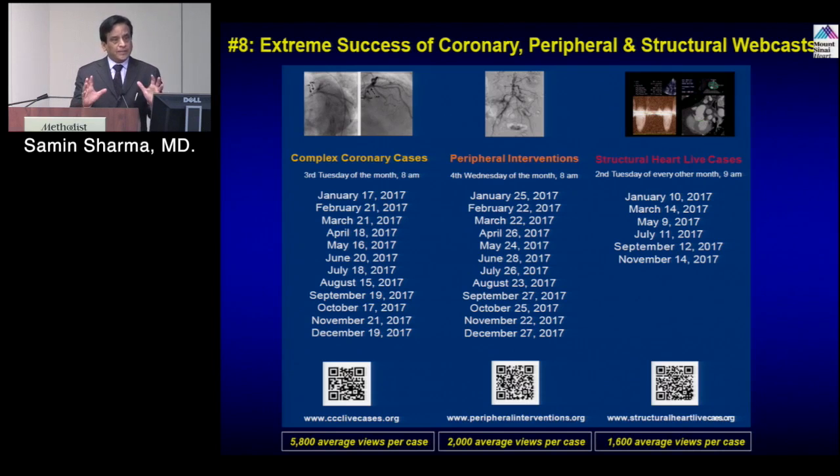Yeah. So very good. That's the important point, is that you have an unexpanded stent case that has been sent to you. Why? Because if you would have been in your lab, you would have used the atherectomy and the stent would have expanded. That doesn't happen in the lab where you are. So we always say that it was sent to you. So now the question is what to do. So clearly use the smallest burr.